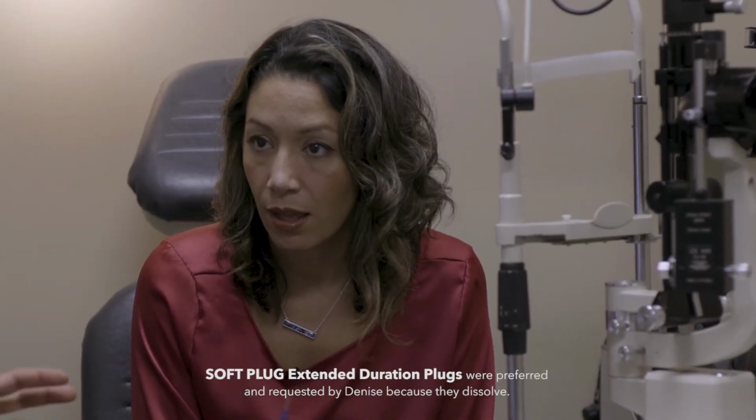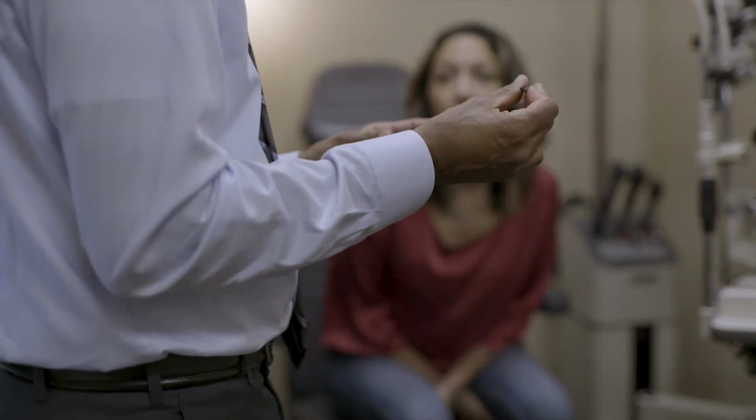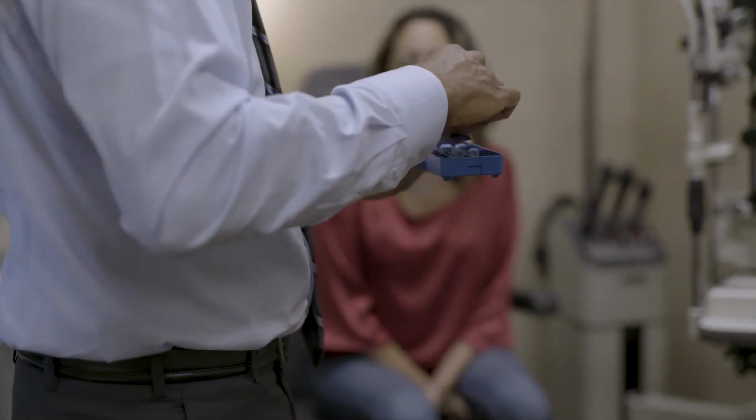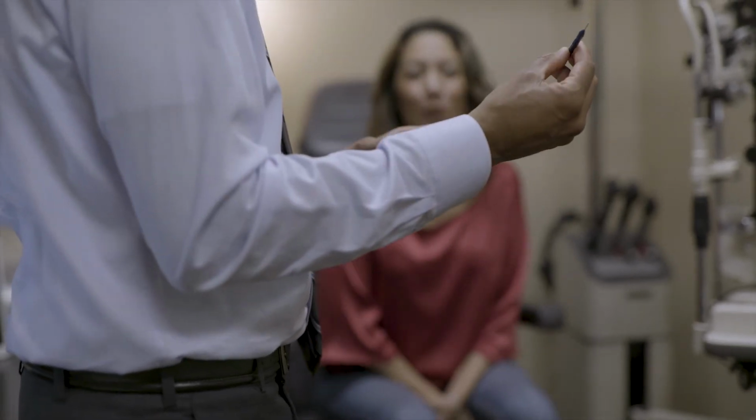The dilation is important because we're trying to open the puncta as much as we can to create that space to put the plug. Yeah, it's going to be a little uncomfortable, frankly. So my predictions are going to be like a 0.5 or 0.6. But you get to test out your predictions. Yeah, so that's my hypothesis. We'll see.